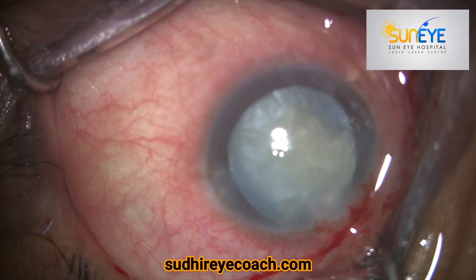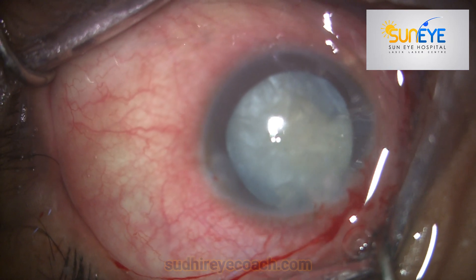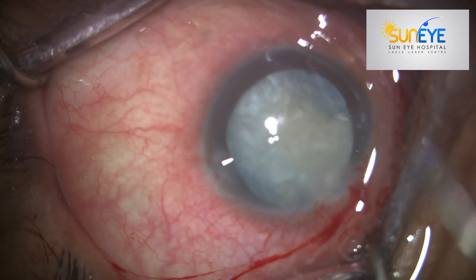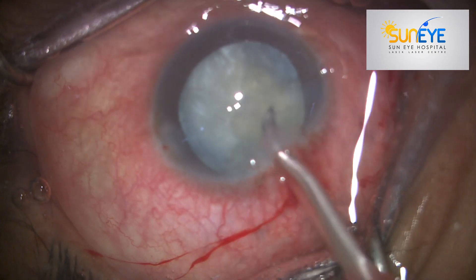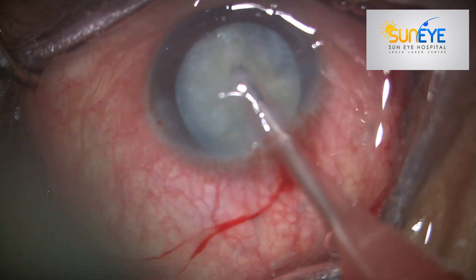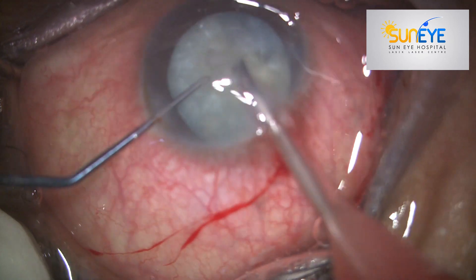Now you can use phaco to complete your fragmentation part. Reduce the bottle height, and if you're using active fluid assist, then reduce the intraocular pressure and complete your fragmentation.